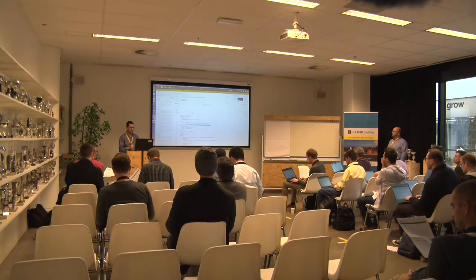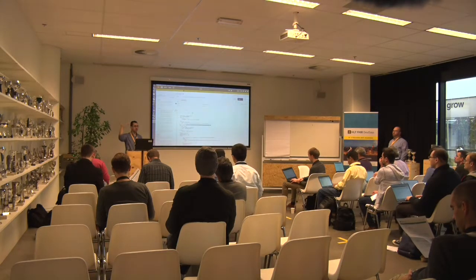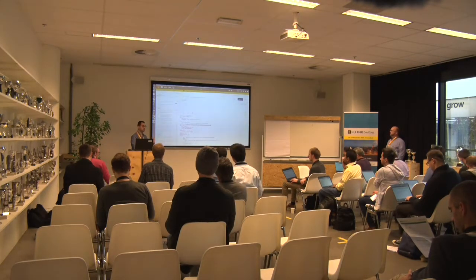And one other thing I'll also point out, remember when I said that link between FHIR and DICOMweb should be here, but it's not on the server? Usually you'll see somewhere in this area an address field, which will say DICOMweb RS or DICOM RS, and then it will have the link sending you directly to the DICOMweb server. If you actually look at the raw JSON data that we store in GitHub, you will see that we are pushing it in, but for some reason the server decides not to show it.